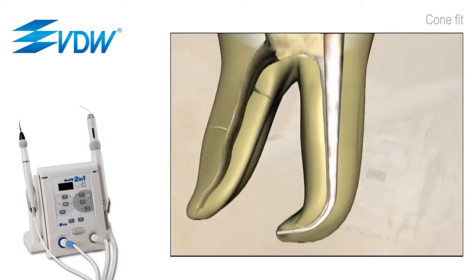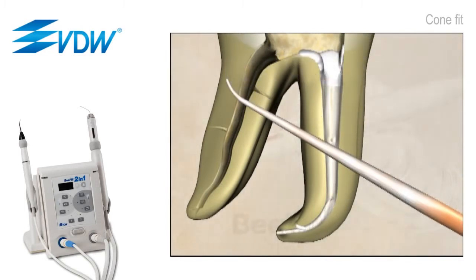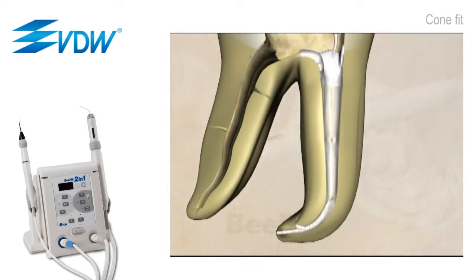It is then coated in sealer and reinserted into the canal space. The sealer adheres to the canal walls as the cone is worked back and forth. A thin coat of sealer is desirable for these techniques, so in this animated example, we remove the cone to show that there is still some sealer on the cone as well as the coating that is left on the canal walls. The cone is reinserted to length.